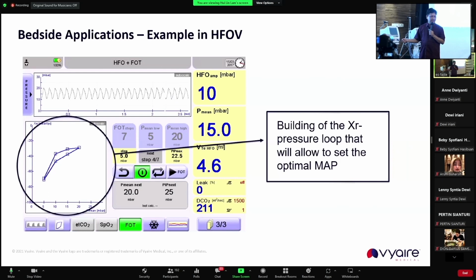Dan pada kasus ini, kan kita lihat reaktan paling tinggi ini, tapi kita nggak ketemu over distensinya. Ya, kan nggak ada over distensi ya. Harusnya kita harus tambahkan lagi stepnya, mungkin nggak 1, 2, 3, 4, 5, 6, 7. Ini ada 7 nih, ini berdempet. Ada 7, mungkin stepnya harus ke 9. Yang ke 8, ke 9 ya.